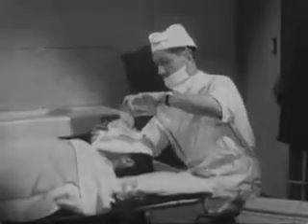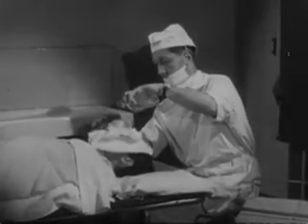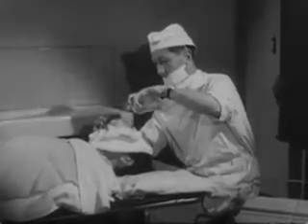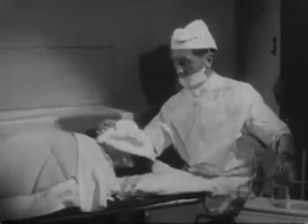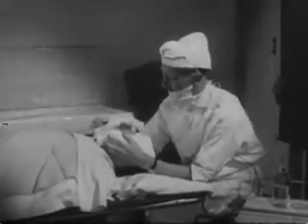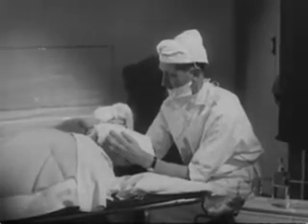Too great a concentration of ether vapor produces laryngeal spasm. If the warning sound of stridor is ignored, the glottis will close completely and breathing will stop. It's a waste of time to continue pouring on the ether, as the patient is taking none in. Keep the mask right away and wait for the spasm to pass off.